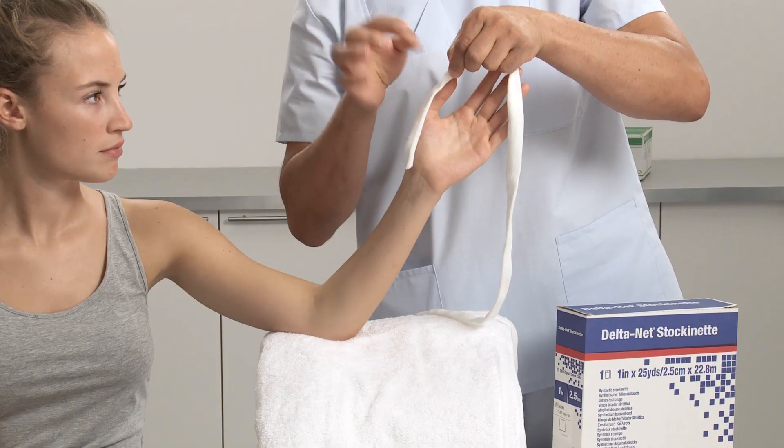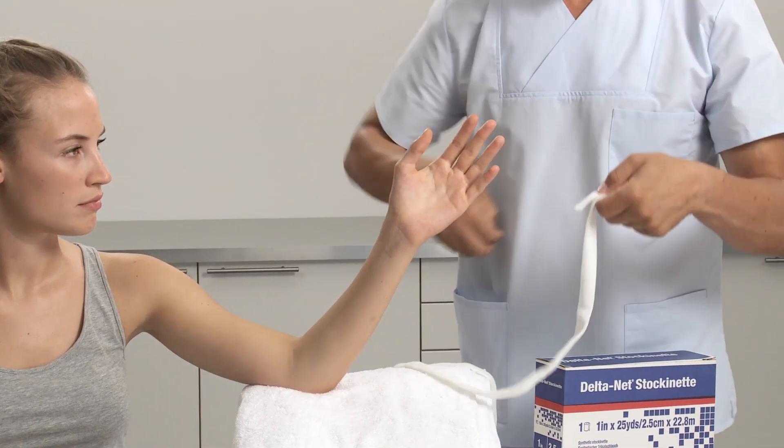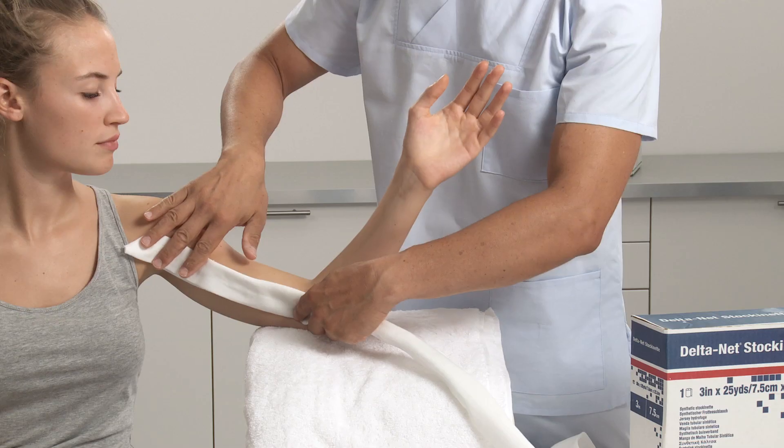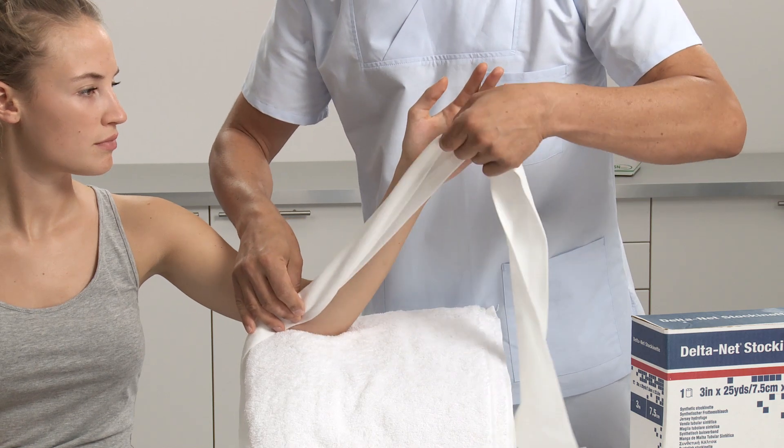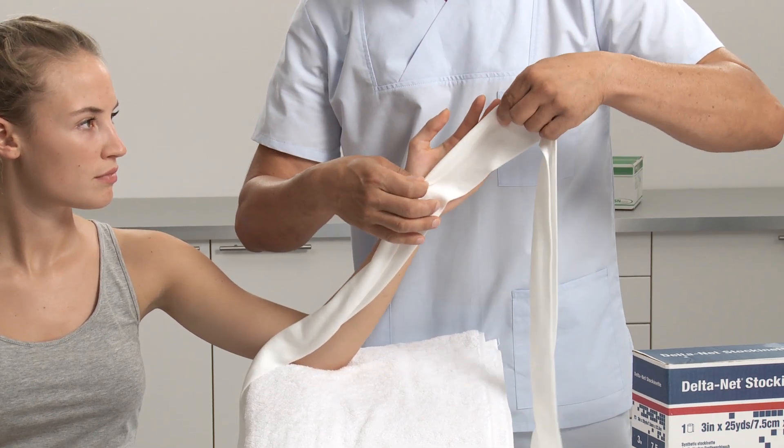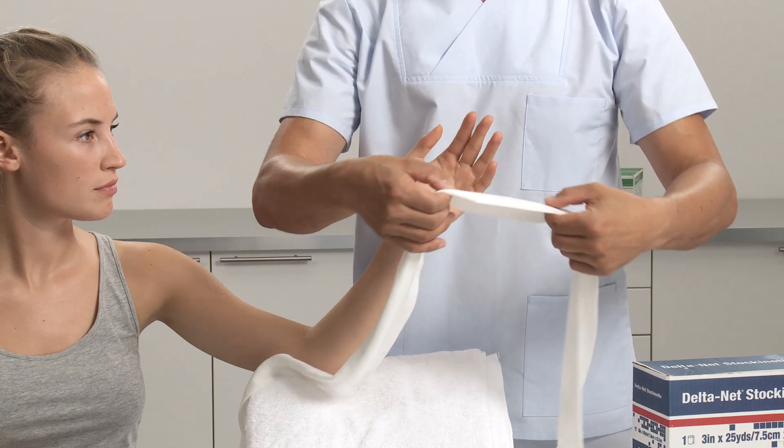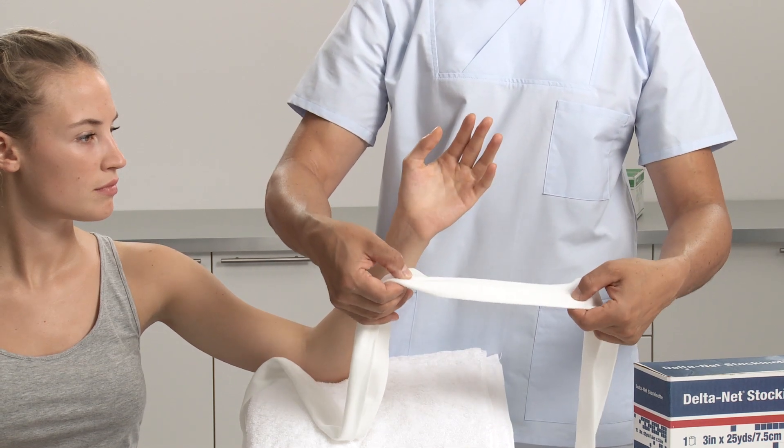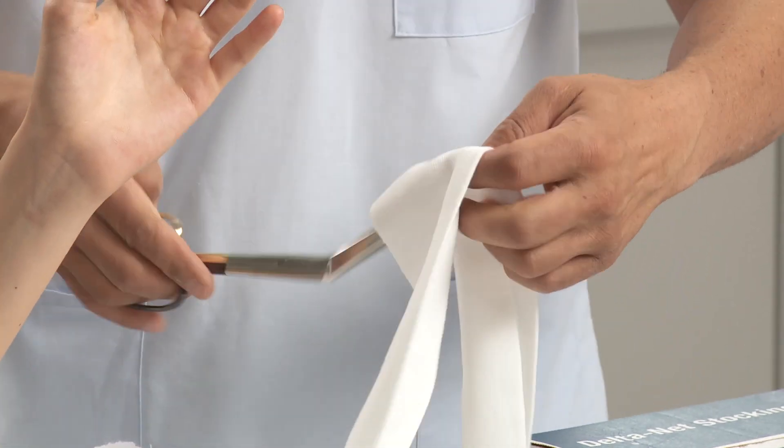Take a double thumb length of 2.5 cm or 1 inch width of stockinette and cut. Then choose the appropriate width of stockinette for the arm. Measure the length from the upper arm to the distal end of the fingers. Add another 20 cm or 8 inches and cut.